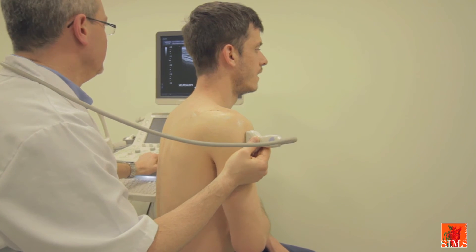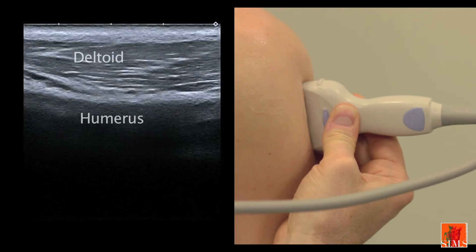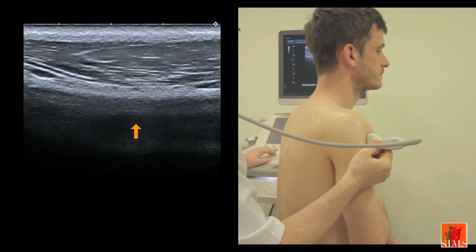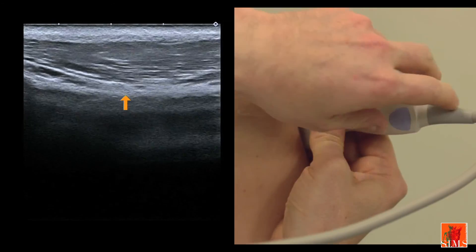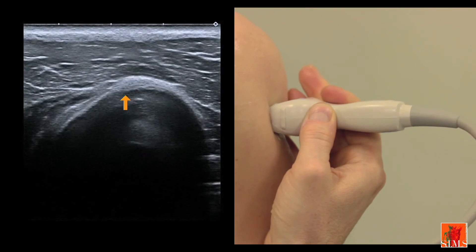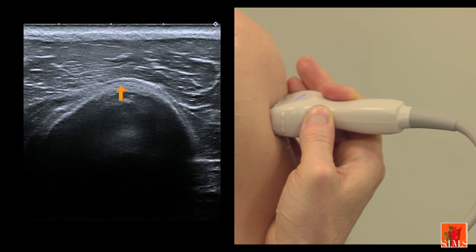We will end with an image of the axillary nerve. This time we locate the axillary nerve on the lateral border of the diaphysis of the humerus. Here you can see the artery, and here is the small nerve, and we will tilt the transducer by 90 degrees in order to obtain the long axis view of the axillary nerve that you see here.